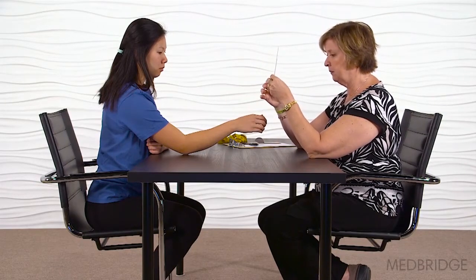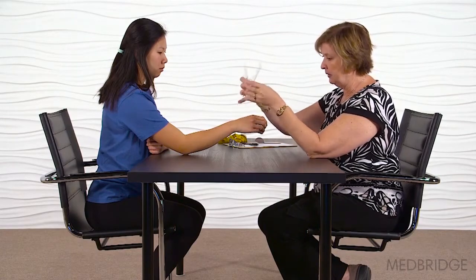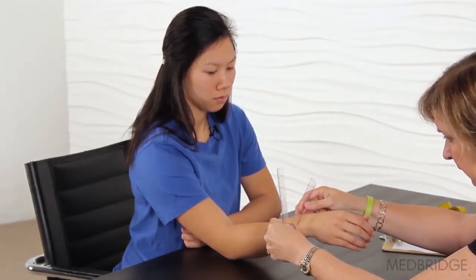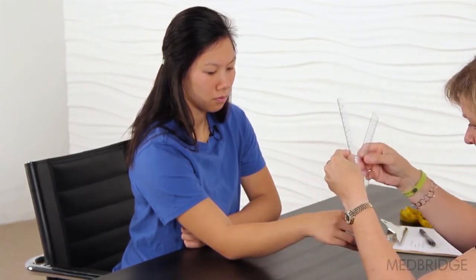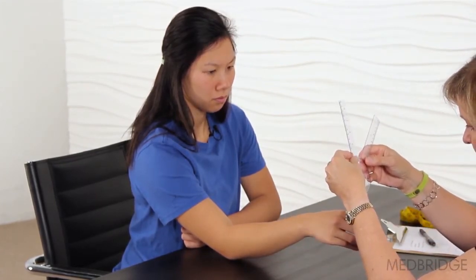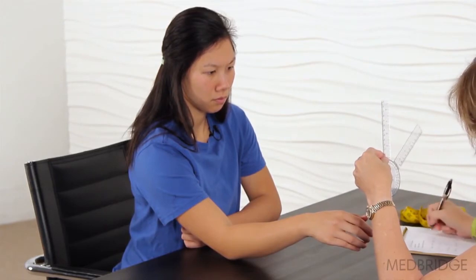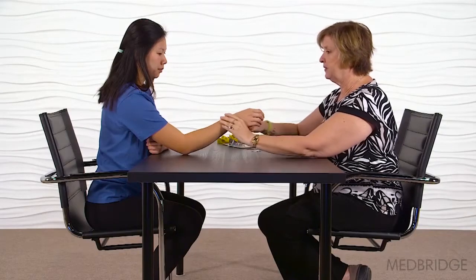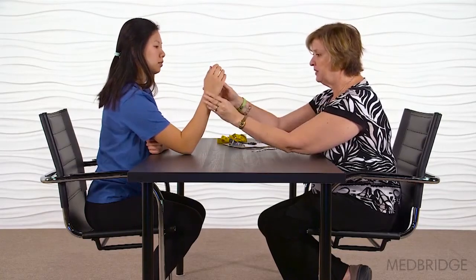And now can you turn your arm back over. For pronation, she has about 55 degrees of pronation.